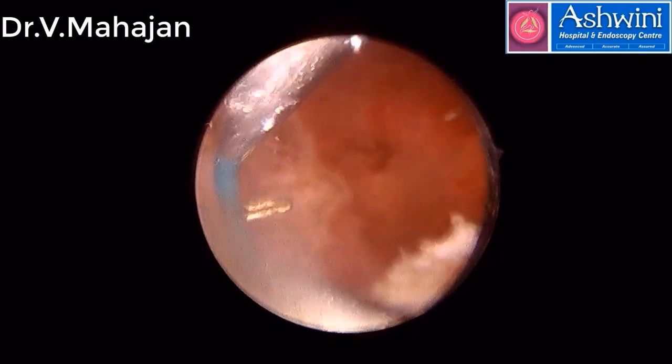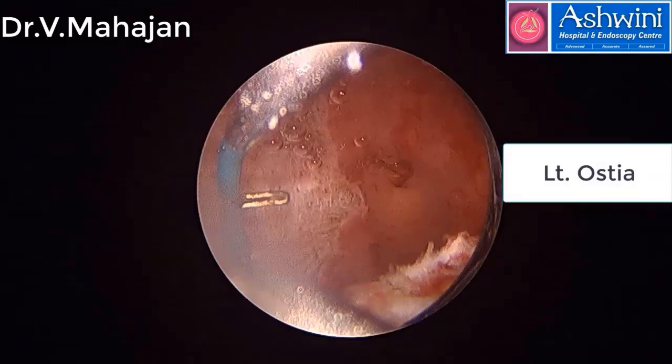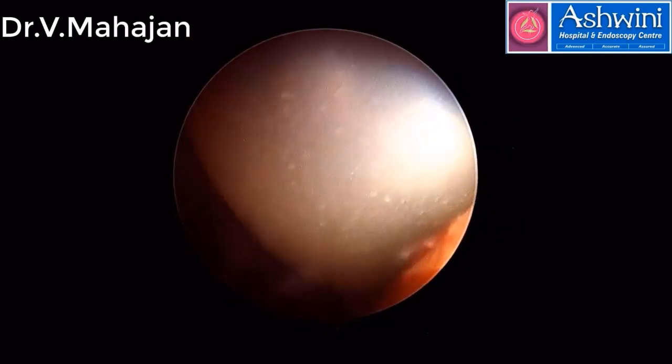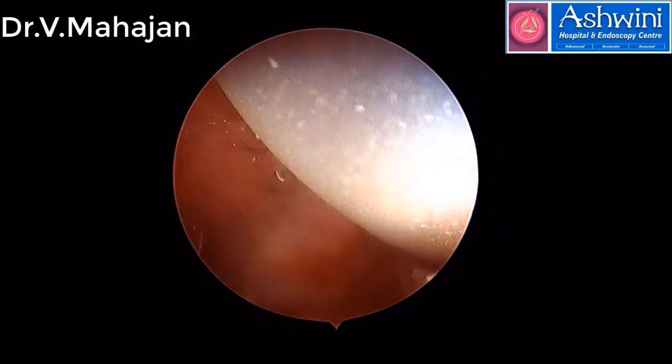So I think I have completed the surgery. The Foley's is inserted to prevent adhesions. And here we finish off the surgery.